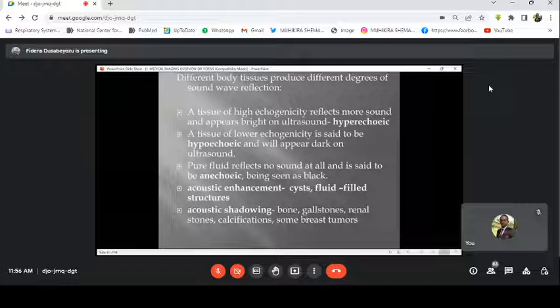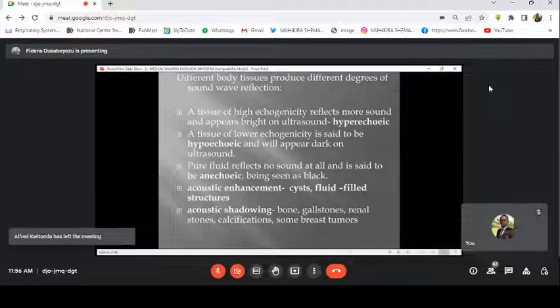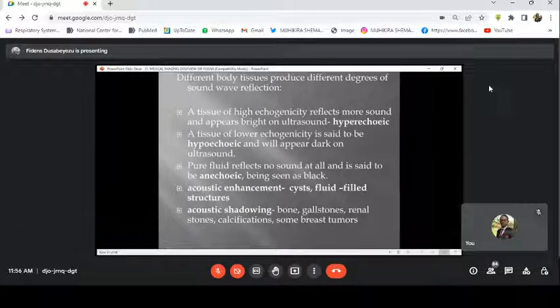A tissue that does not reflect much echoes is called hypoechoic, because it doesn't reflect much sound waves. It will appear dark on ultrasound. Do you understand those two? Differentiate those two. Tell me, can one explain to me? Yes. Tell me your name and explain to me.